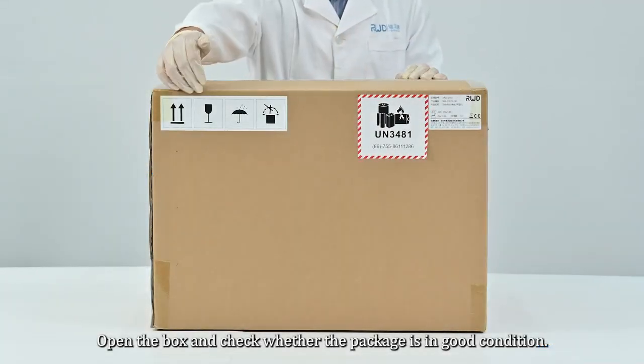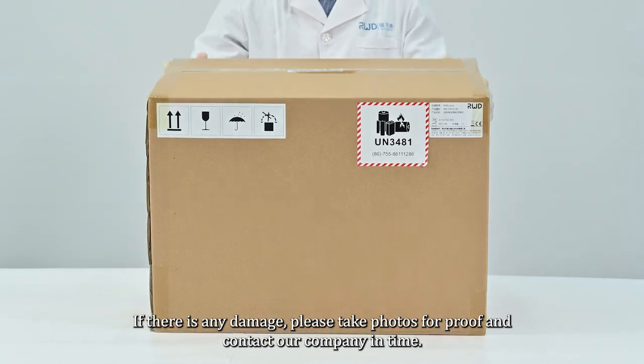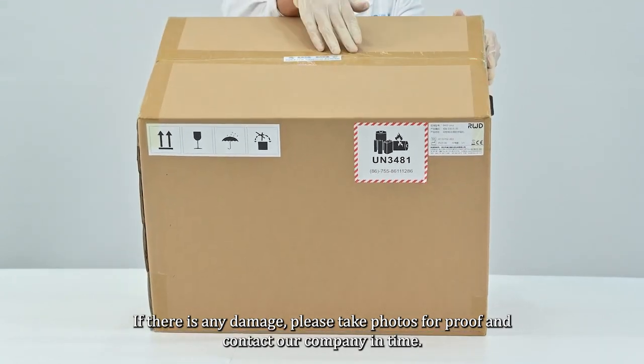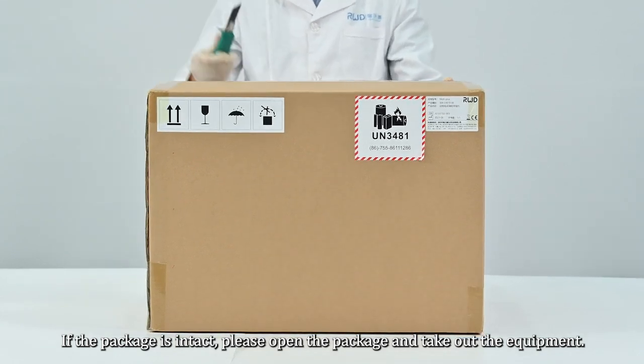Open the box and check whether the package is in good condition. If there is any damage, please take photos for proof and contact our company in time. If the package is intact, please open the package and take out the equipment.